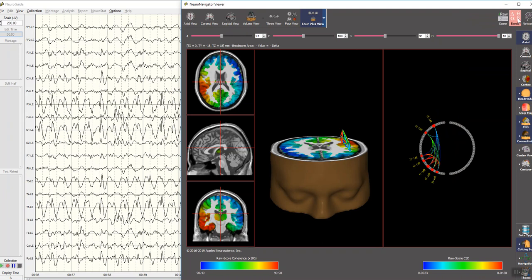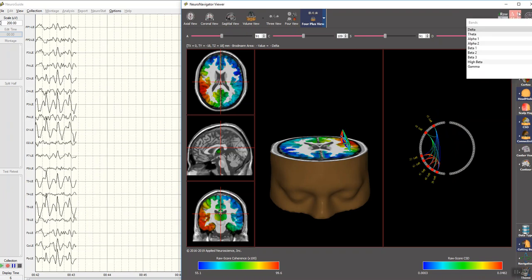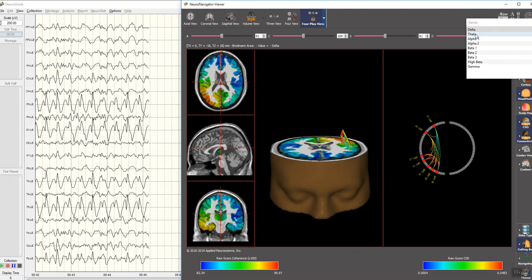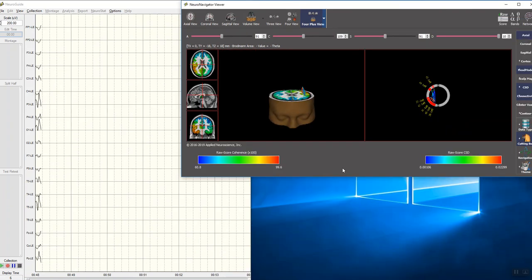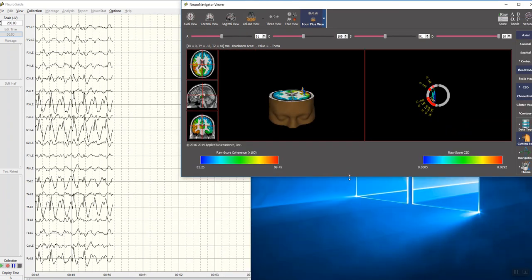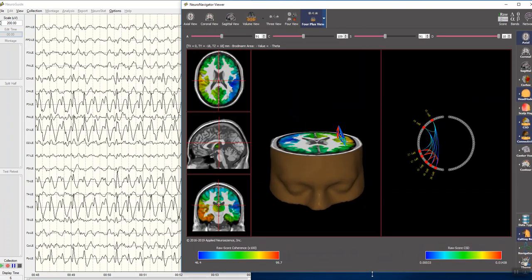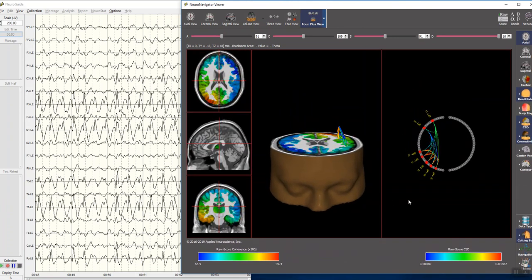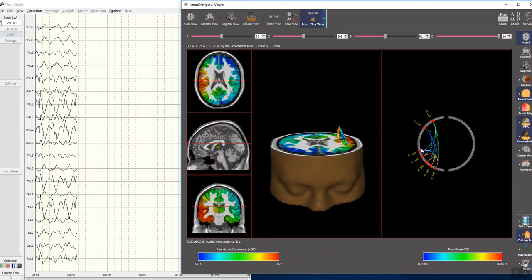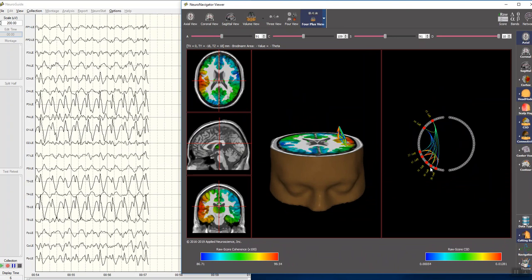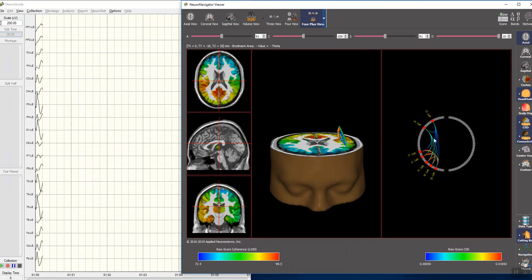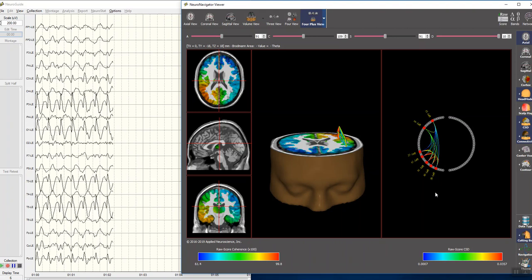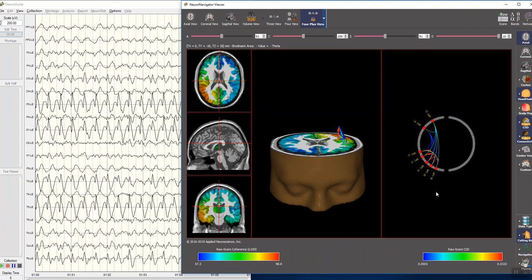We can do this for different frequencies. I'm going to do this now for theta. And we have the same controls, but this now you can see the short distance language network as well as the long distance, the frontal temple and the frontal occipital aspects of language.